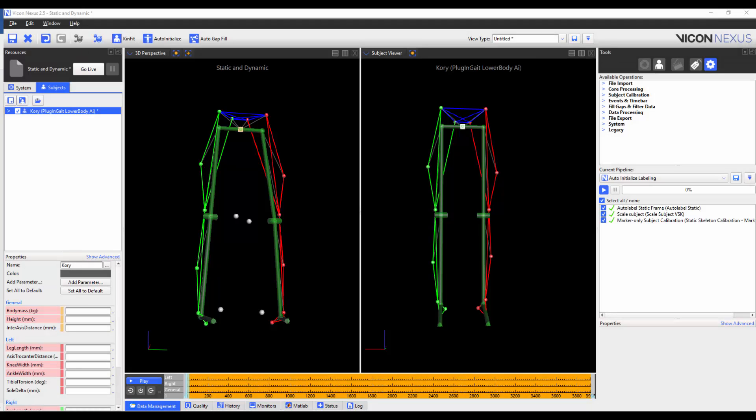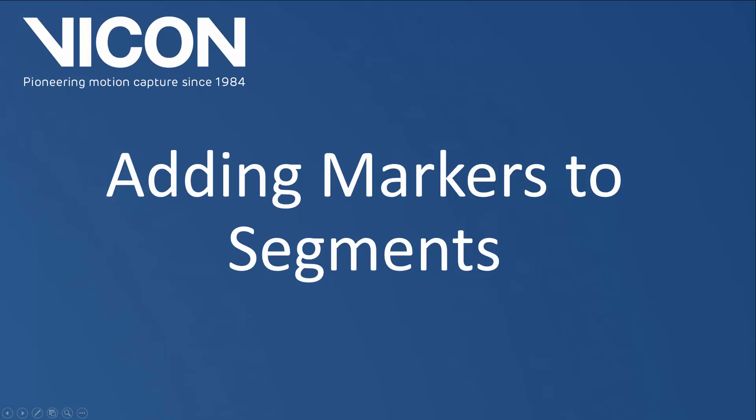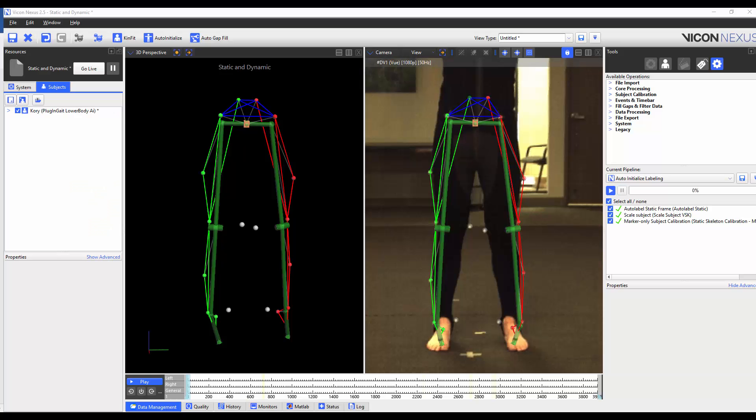Finally, I'm going to save the subject and save the trial. Now that we've calibrated the VSK, we're ready to add markers.